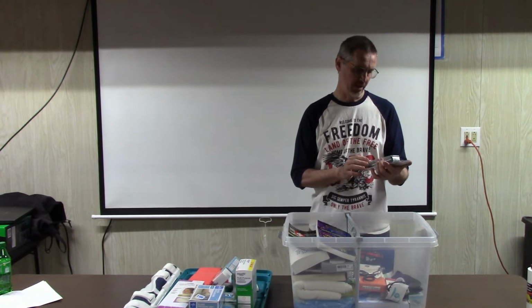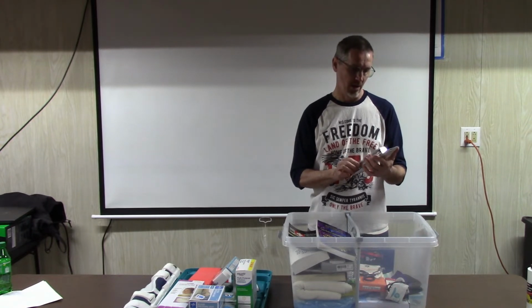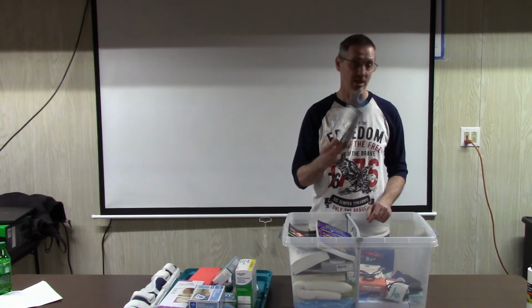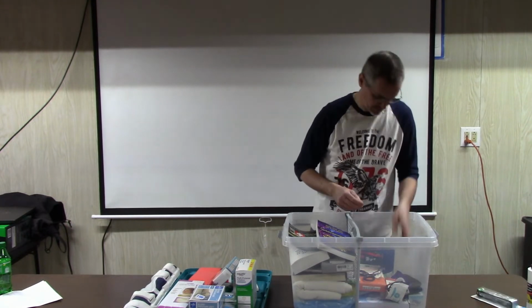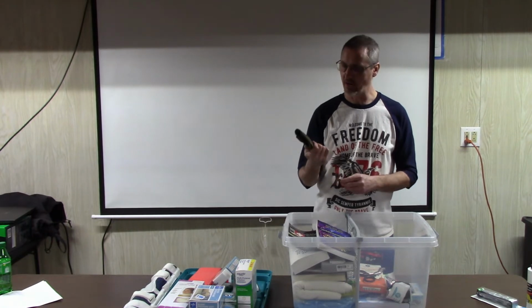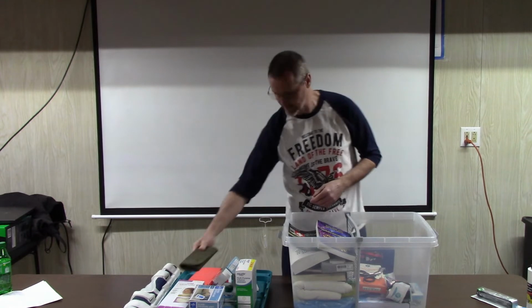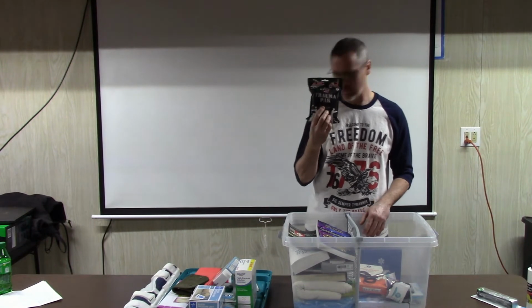Something else we picked up at probably one of the farm stores, disposable scalpels. Again, this got in the wrong box. It should be in the animal box because it says for veterinary use only on it, but there's some disposable scalpels. This is like a military surgical kit. It's got the forceps and scalpels and so forth in it. The quick clot trauma pack, I think we've got a few of these.